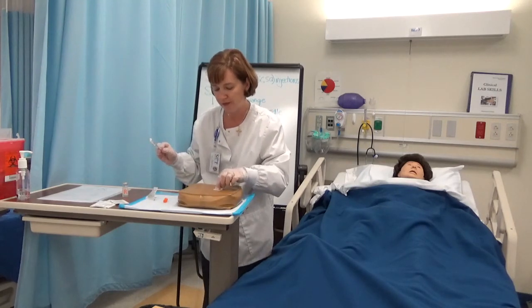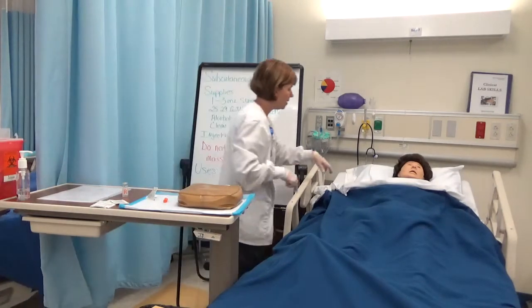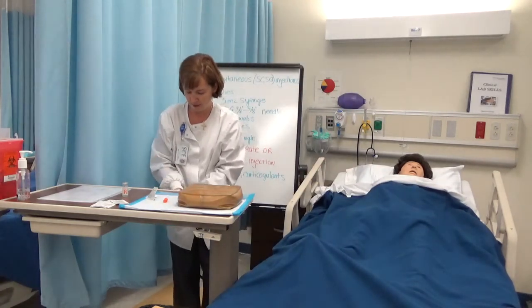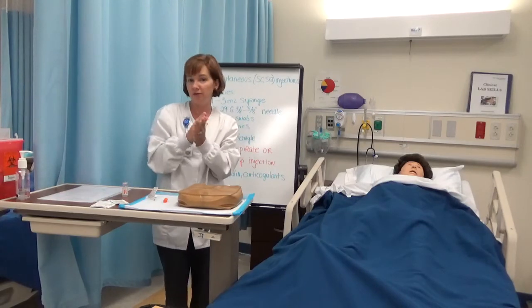Quick little wipe. Put that in the red box. Okay, Mrs. Cross, I'm all done with that injection. And take off your gloves. Wash your hands. And that concludes our demonstration for sub-Q.